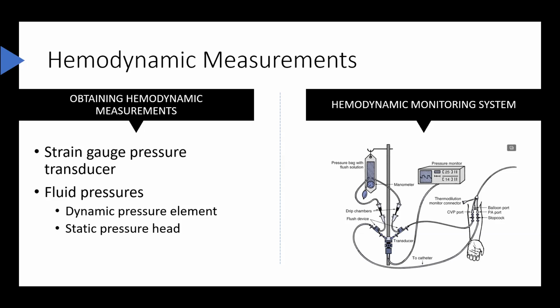A pulmonary artery catheter, which measures pressure within the vessel, such as the pulmonary capillaries or the left heart chamber, must be placed so that the tip of the catheter is facing downstream of the flow of blood to estimate blood pressures filling the left side of the heart.